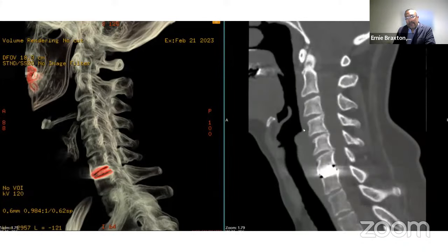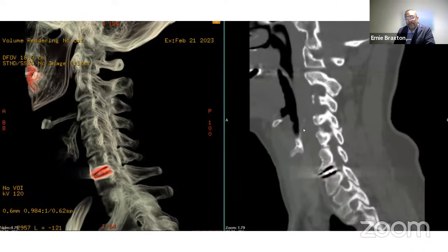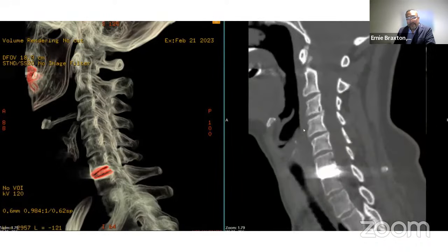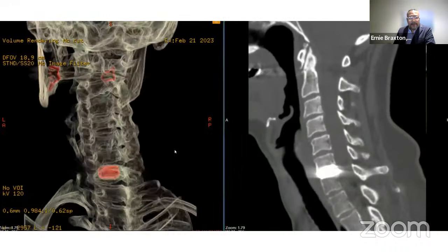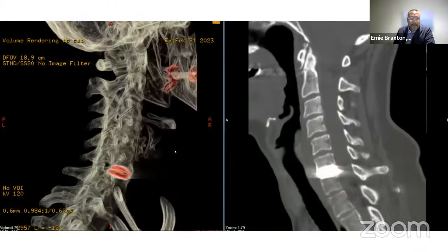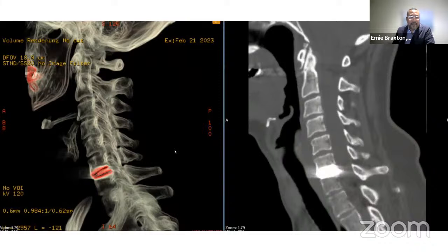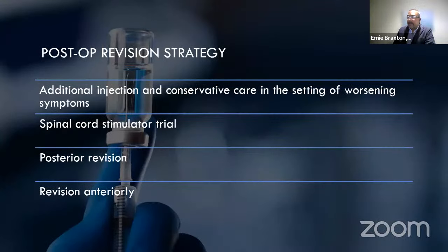She has some facet disease at C3/4, but I thought 5/6 was pretty good, and I thought 6/7 was still pretty good. I don't really find these 3D things all that useful. They got one for me. You can see that it's locked in kyphosis. And although I didn't show the flexion-extension films on her, the disc didn't move anymore, as opposed to how it started in the first few years.